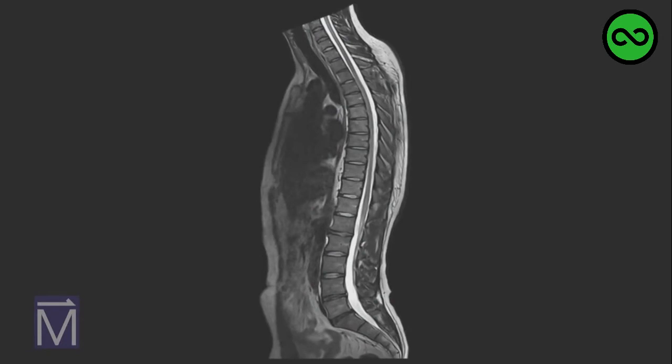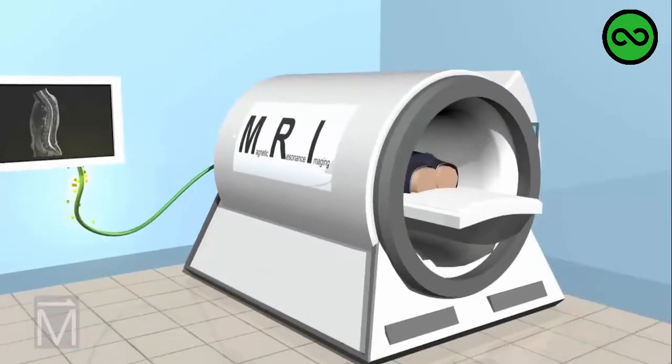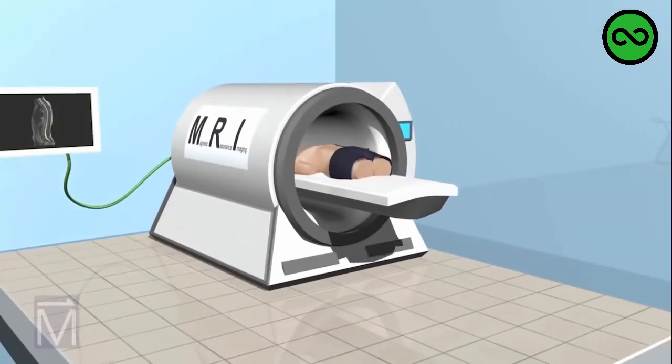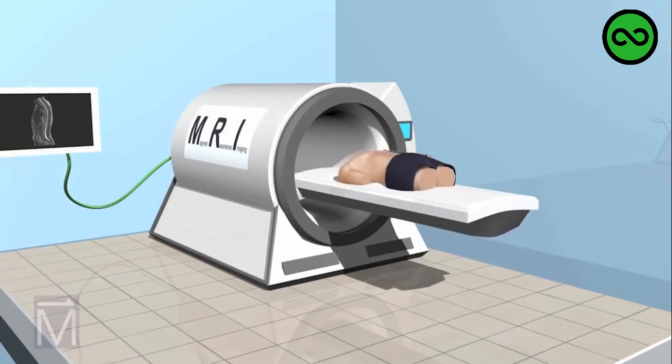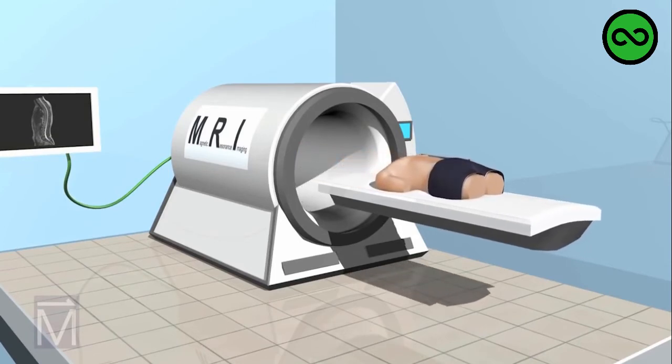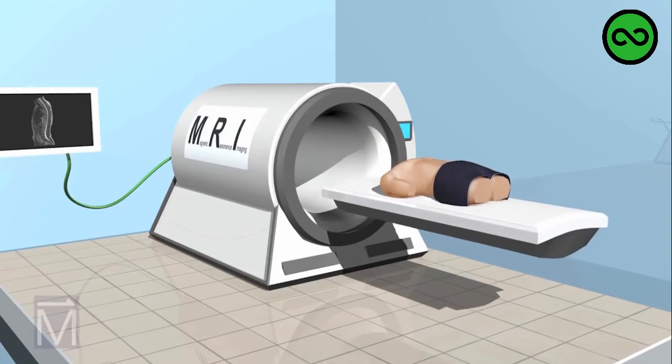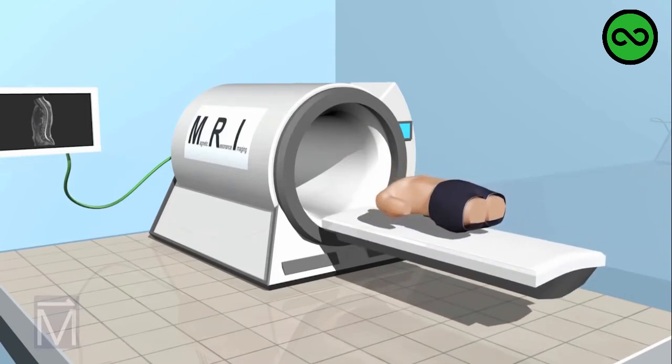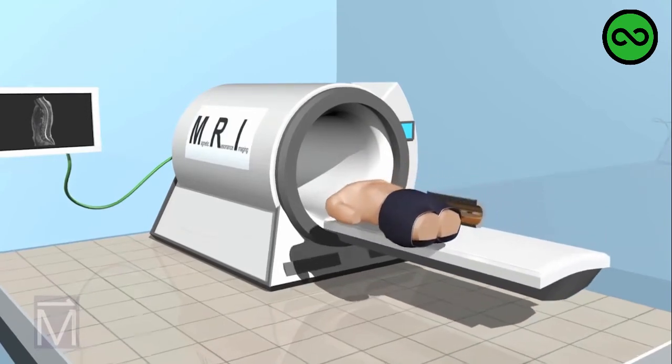Tissue with less water in it will have fewer hydrogen protons to emit signals back to the RF coils. Those areas appear darker on MRI scans. The varying signal strengths get translated into various shades of grey, which radiologists recognize as different types of tissue on the scan.